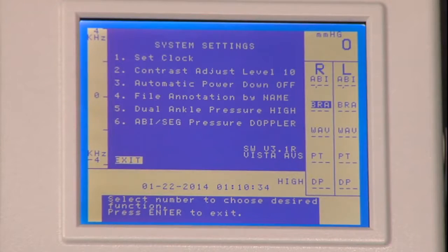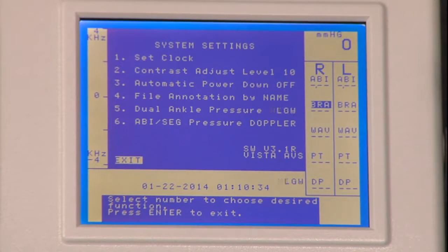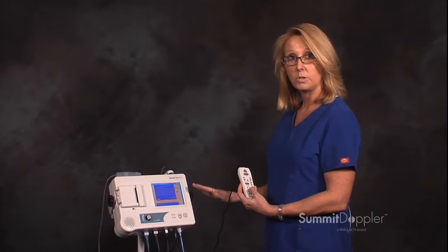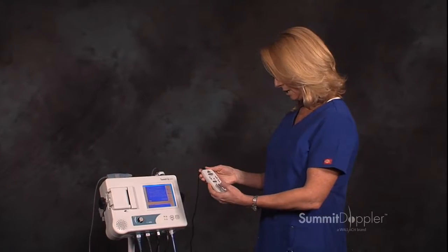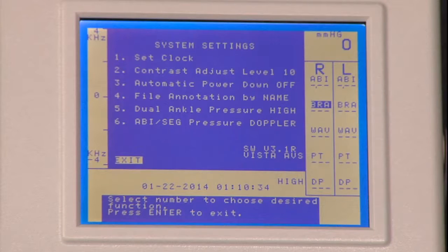Option number five is dual ankle pressure, set to high. Pressing number five changes that to low or off. Some ABI exams would need this turned off. In general, you will have that on high so that you have the PT and DP option on your menu.